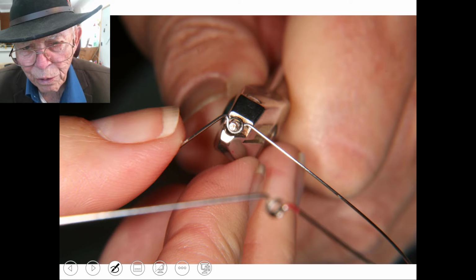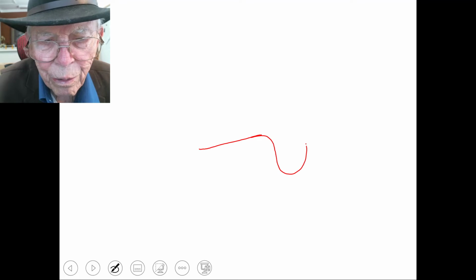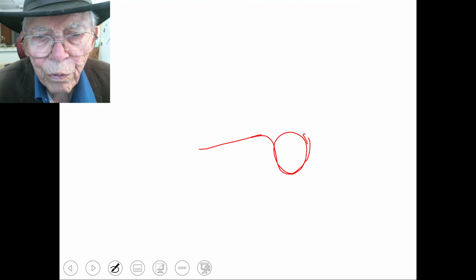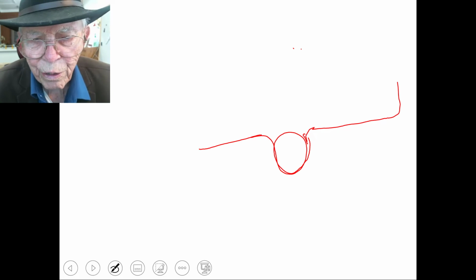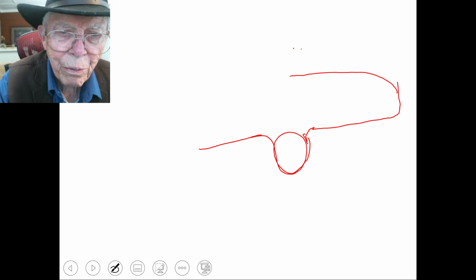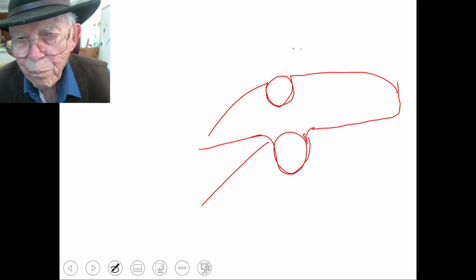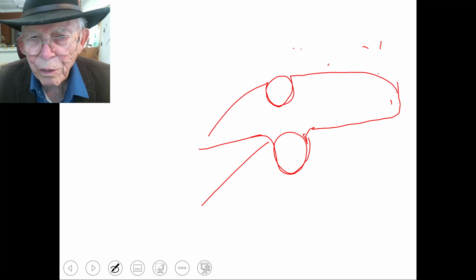I'm going to just make a white screen here and show you where if you come like this and then you bend it slowly and come around in this fashion, and now we get up here and we bend it over a round part of that plier, and the wire goes out like that. Now we're going to make this over here. This wire, if we make this coming over here and we make another one like that, and we activate both of them, and we're going to pick this up, this front part will go up, and we're going to come down and hook it to teeth, and then get that thing to raise that up.